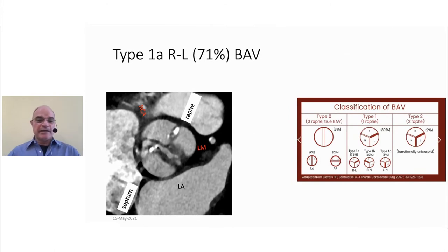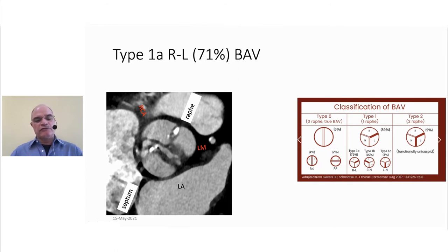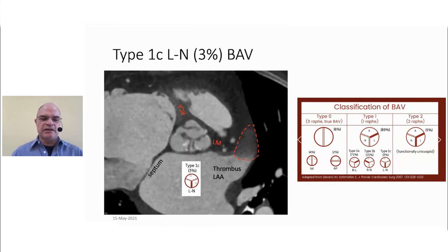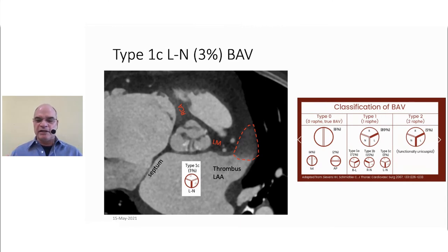The more common type 1 — here's an example of a raphe between the left sinus and the right sinus. You can see the left coronary artery, LAD, right coronary artery, and the interatrial septum. The three-dimensional high spatial resolution allows you to see this level of detail on the native aortic valve in the setting of thickened leaflets, stenosis, and coronary and cardiac motion. Here's a right-to-non-coronary fusion, or type 1b, with 15% prevalence. And lastly, the type 1c, where we have fusion between the left sinus and the non-coronary. The detail available by doing a four-dimensional CT is truly astounding.